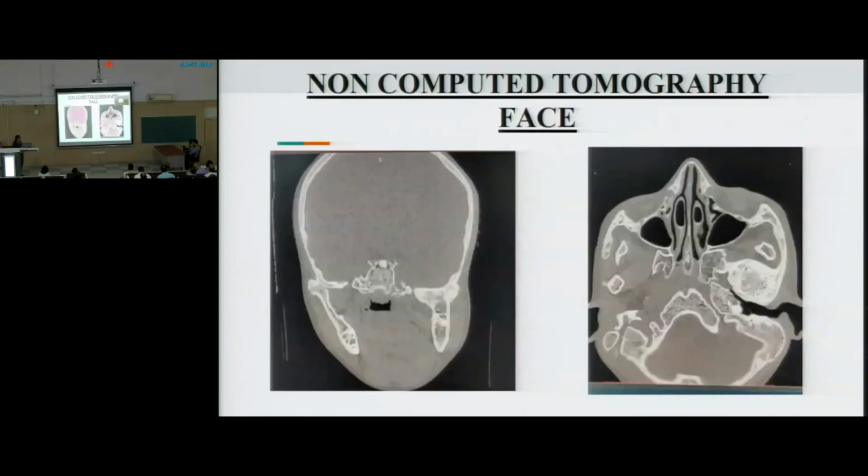And for her, since the deformity was too much, we had to plan for the distractor first, and then after the distraction and after the mandible has come forward, plan for the TMJ ankylosis release. This is the CT of the patient where bilaterally there is articular space obliteration. This is the coronal section, this is the axial section, and bilateral intra-articular space obliteration is there with condylar fusion showing TMJ ankylosis bilaterally.